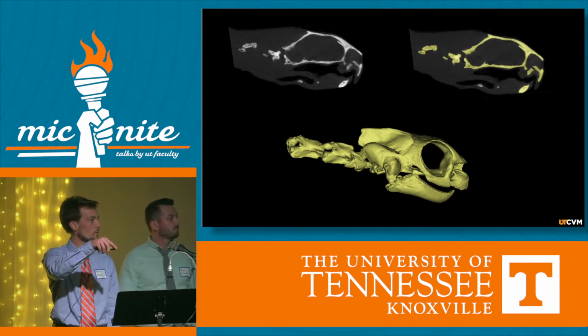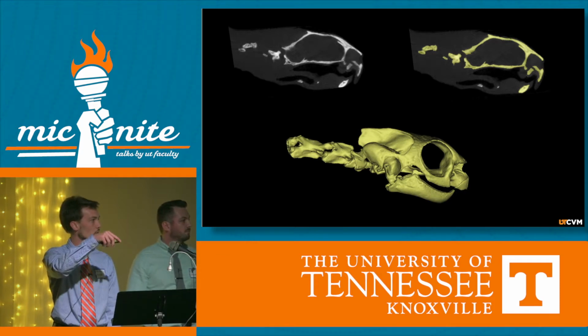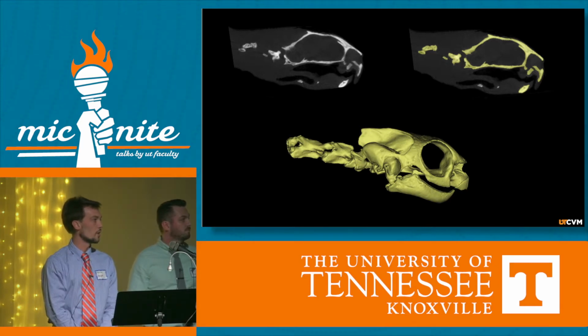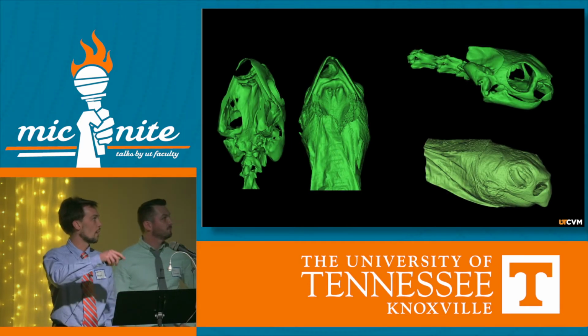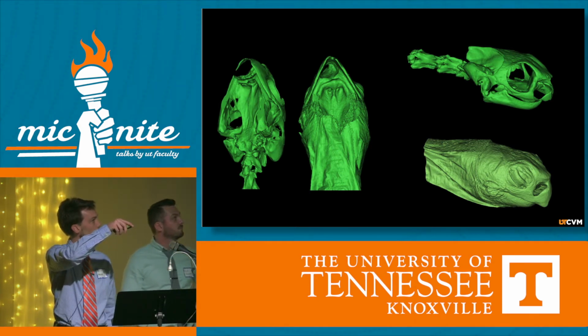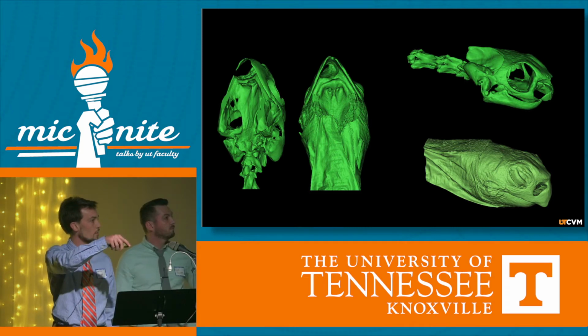So that's where the eyeball would be, the nose, the lower jaw, the spine. You can appreciate that there's a defect between the nose and the mouth. The soft tissues, which is the flesh, also have a big component in the problem. On that view, you can see the nose there and the mouth. So there is dirt which can go in and food which can go out. Same thing on that view there.